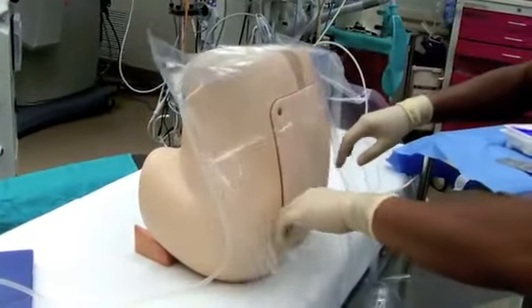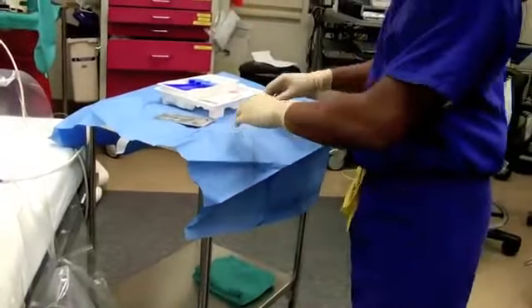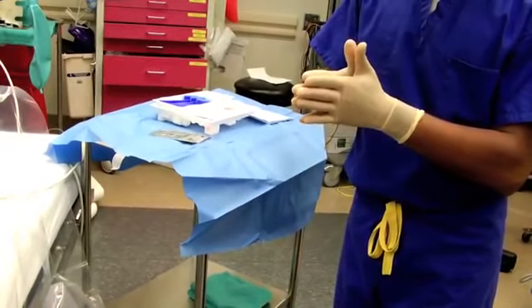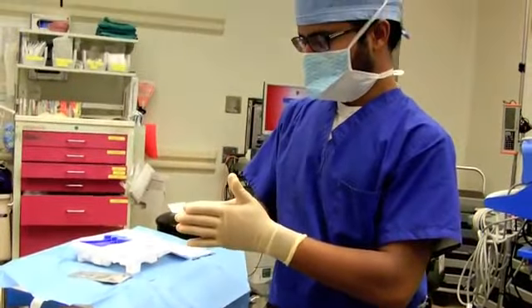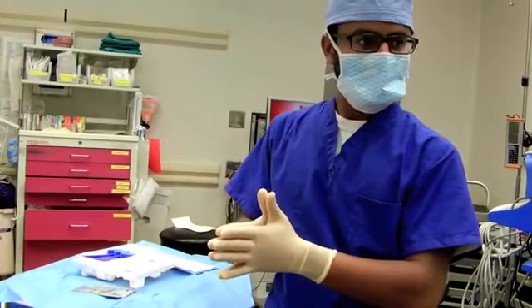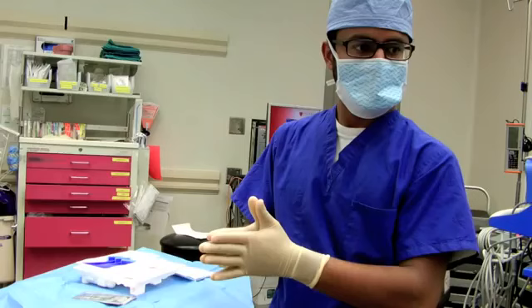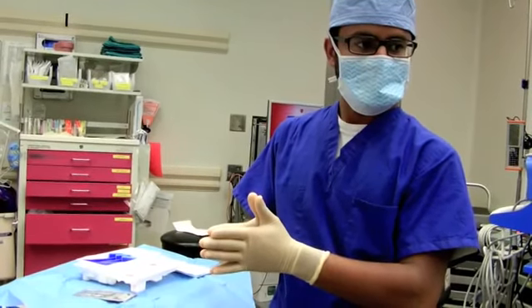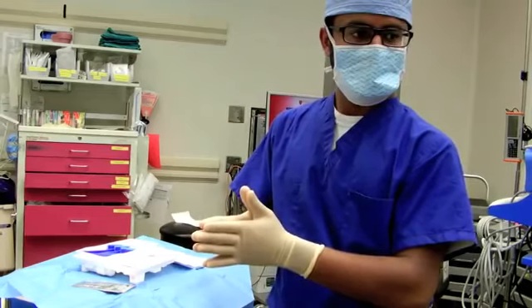Verify the content of the anesthetics before drawing it up. Draw up lidocaine in a 3 cc syringe and bupivacaine in the 5 cc syringe. Warn the patient that you are about to administer local anesthesia. Re-identify the intended interspace after the patient is prepared and draped.